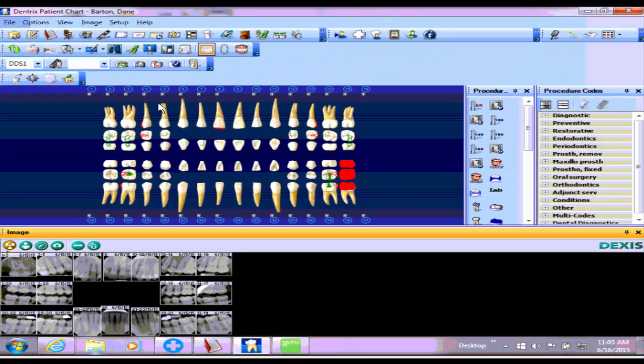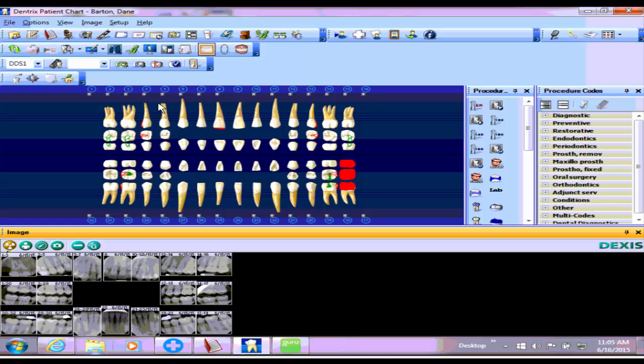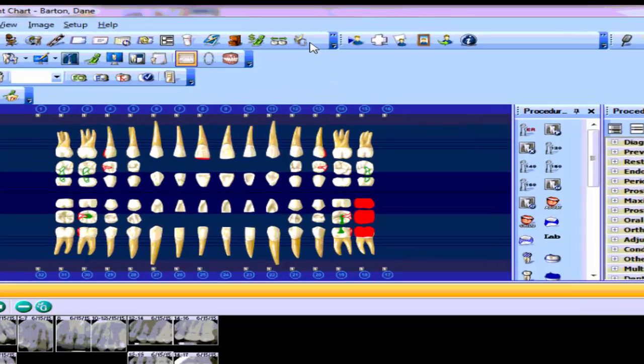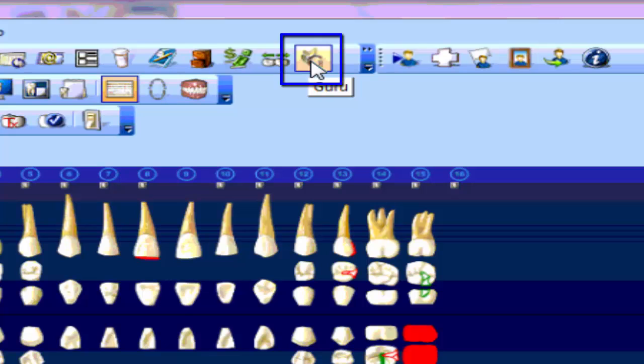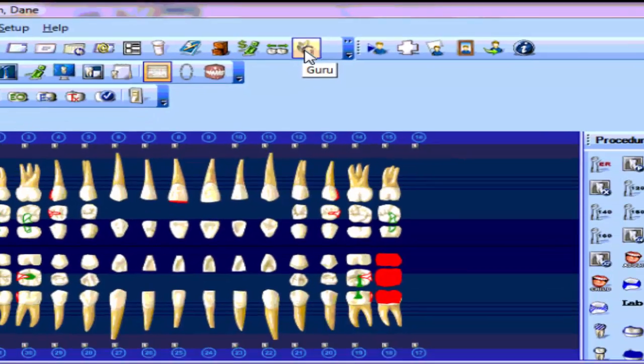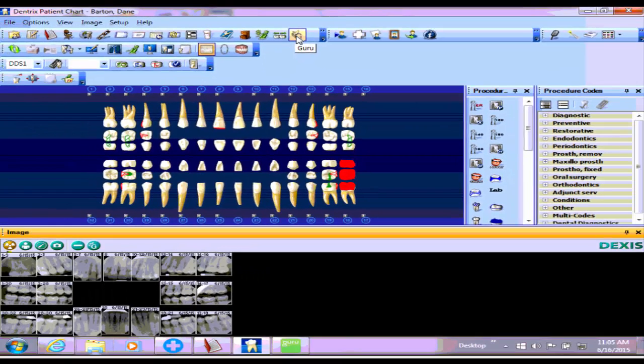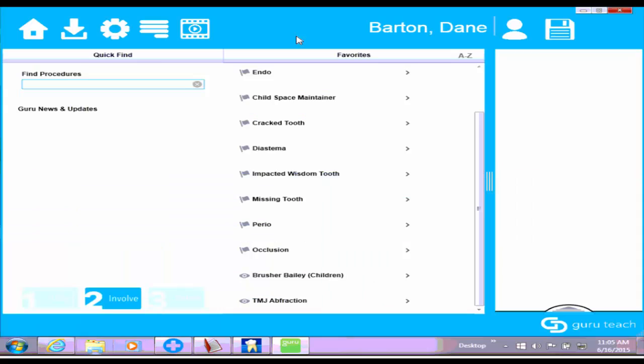I have two places that I can access Guru from this screen. The first is this G icon up here at the top. If I just want to see if this patient has any history in Guru, I can click on this icon and it will open up this patient in Guru. You can see their name up here at the top.